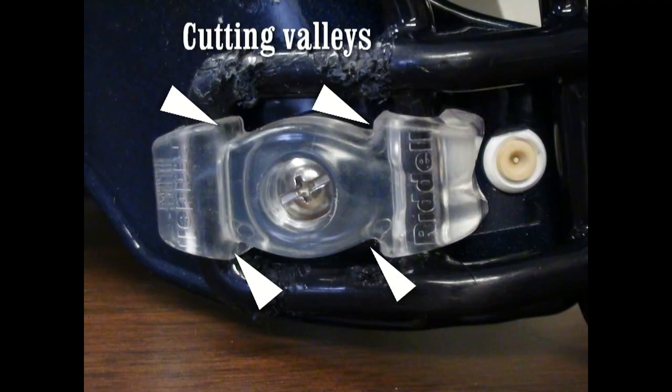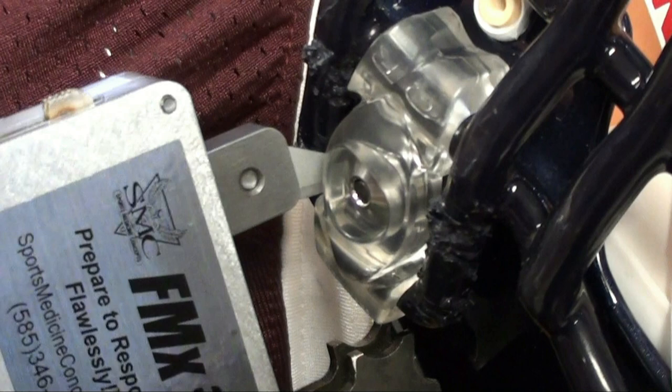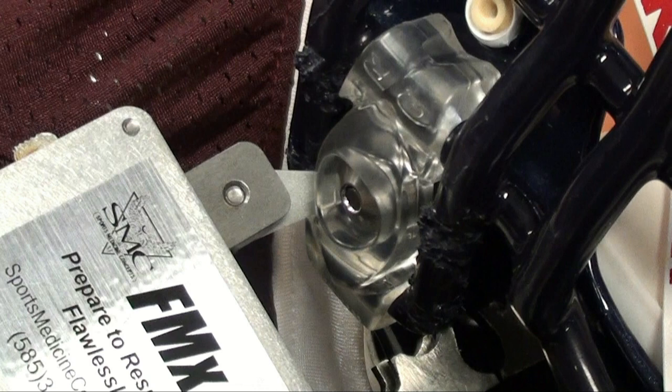Next, identify the tapered cutting valleys in the bowtie fastener. Place the blade of the FM extractor in between the face mask bar and the cutting valley of the bowtie fastener, perpendicular to the face mask bar. Carefully rotate the blade of the FM extractor so that the cutting surface of the blade rests in the cutting valley of the fastener.